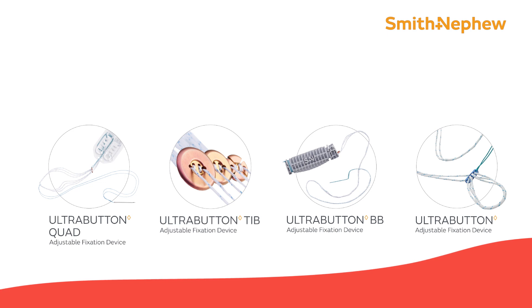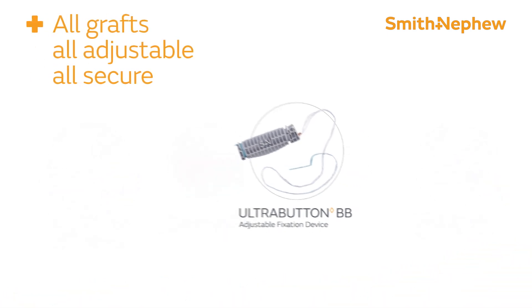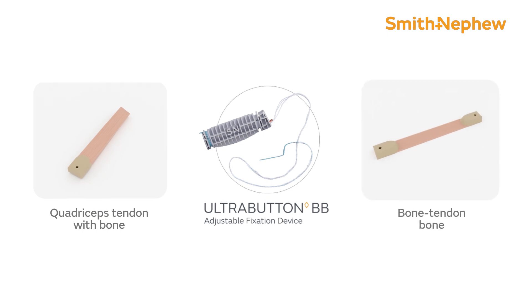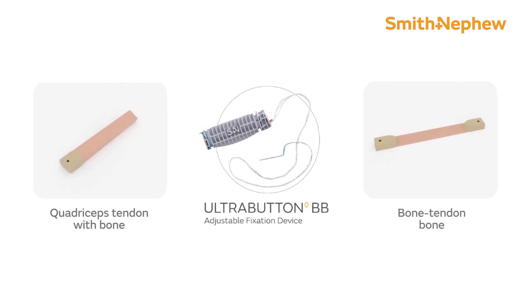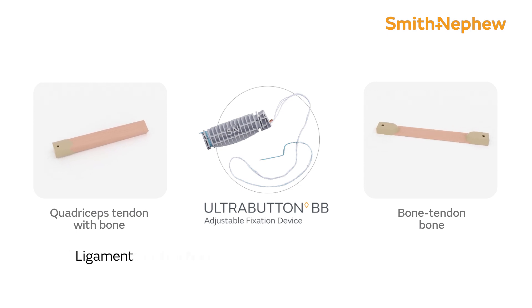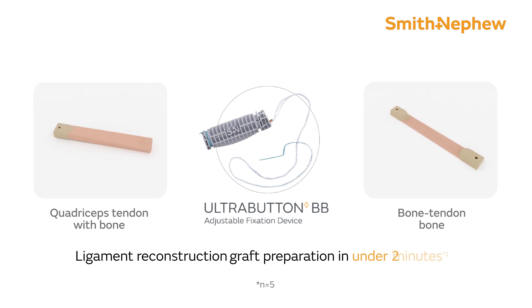The Ultra Button BB Adjustable Fixation Device, part of the Ultra Button adjustable fixation family — all grafts, all adjustable, all secure — is designed for ligament reconstruction. It features an open loop design to facilitate attachment to BTB or QTB grafts in under two minutes.